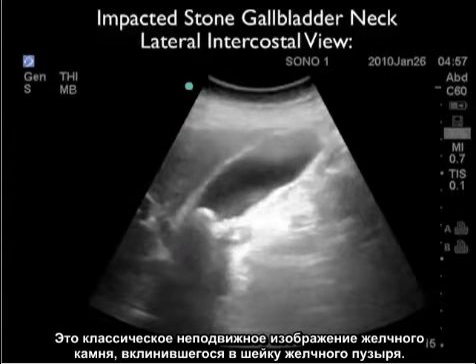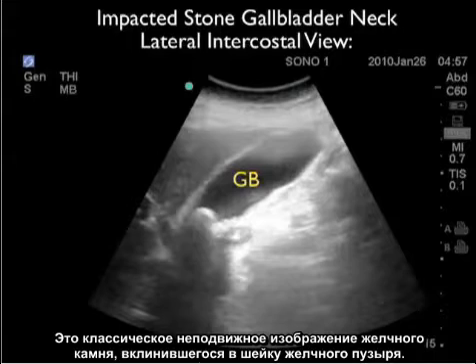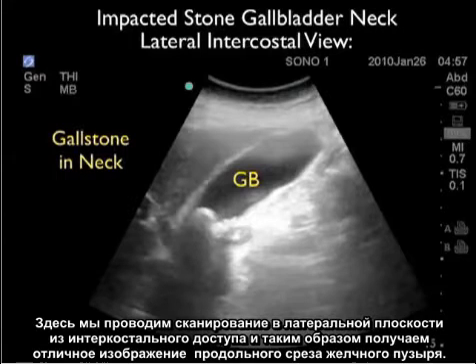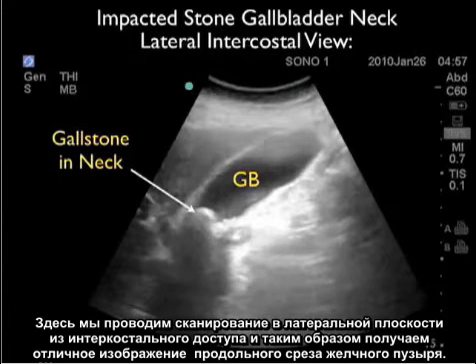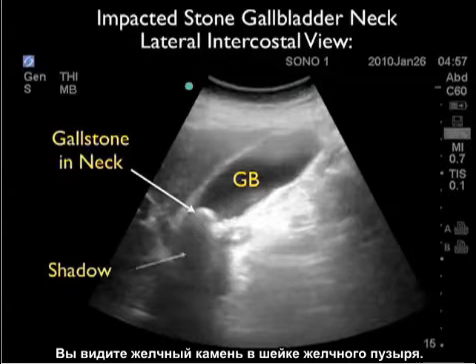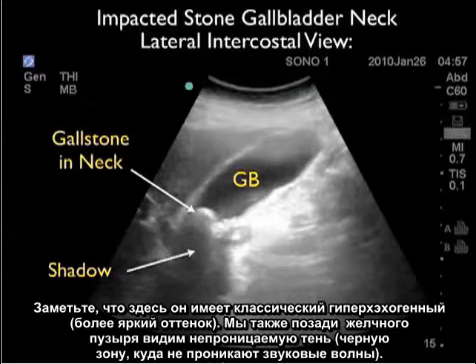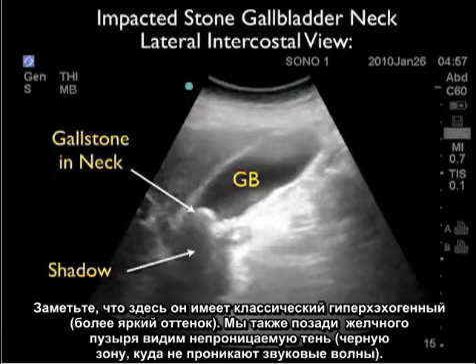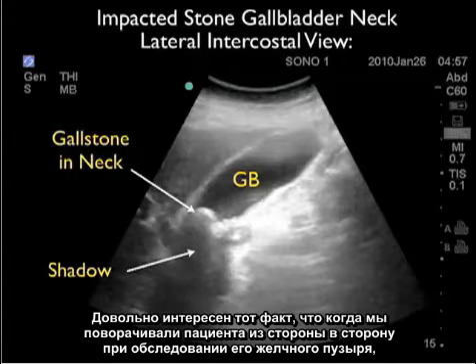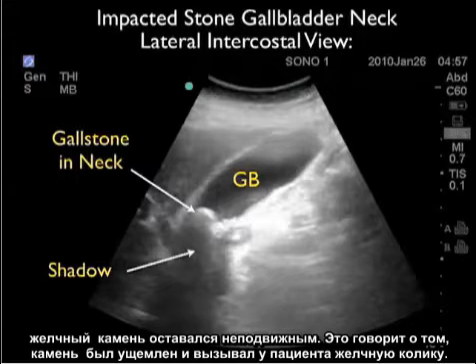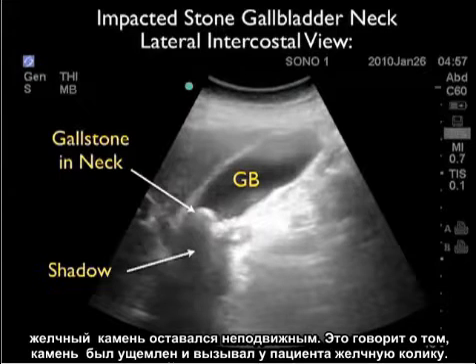Here's a still image showing the classic appearance of an impacted stone at the gallbladder neck. We're looking through the lateral intercostal view, giving a nice long axis view of the gallbladder. We can see a gallstone located within the neck — it has the classic bright or hyperechoic appearance and a hard shadow, a blackout of sound waves posterior to the gallstone. Interestingly, as we rolled the patient around and inspected the gallstone, it failed to move, showing it was impacted and the cause of the patient's biliary colic.